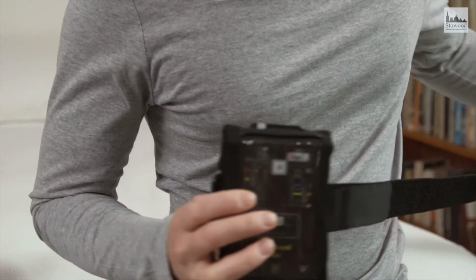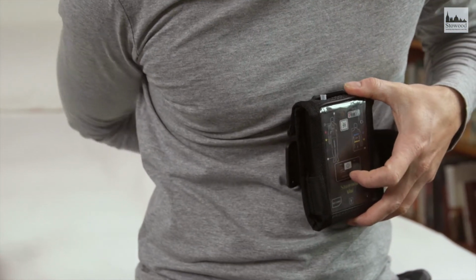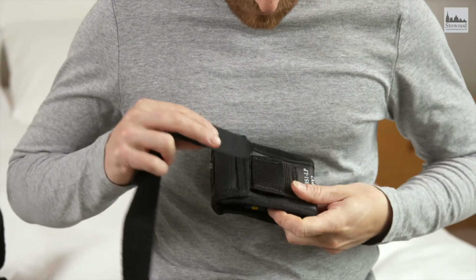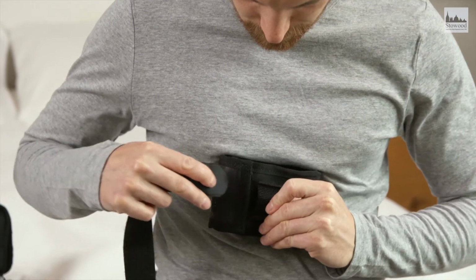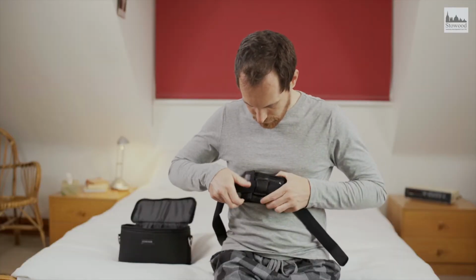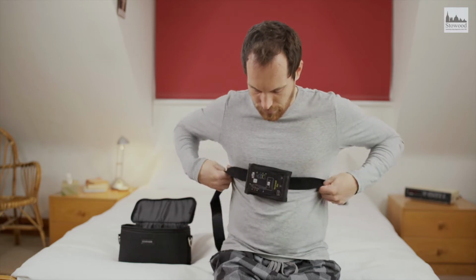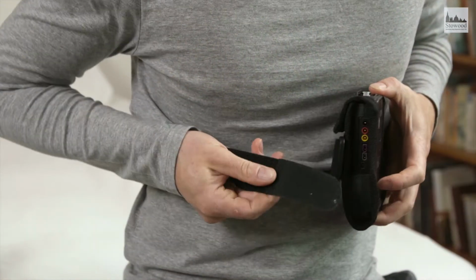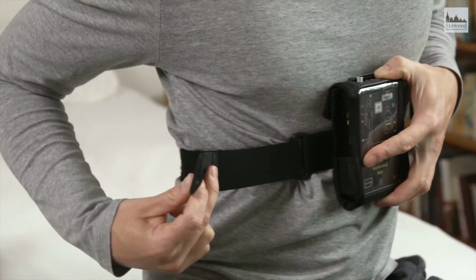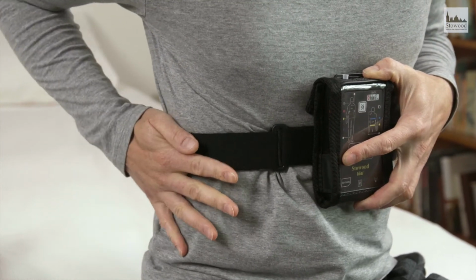Secure the sleep recorder over the sleepwear around the chest. The normal method is to wear the device upright in portrait orientation. You may find it more comfortable to wear the device sideways. If so, thread the strap through the band on the pouch, which enables this. Fold the straps around the buckle and tighten so you can easily and comfortably breathe. Gently push the end of the strap against the rest of the strap to fasten the Velcro.